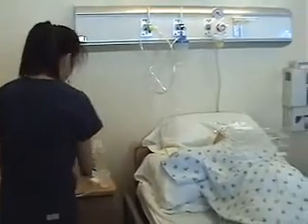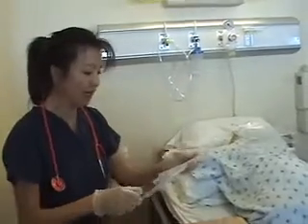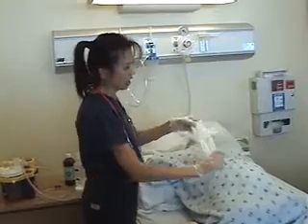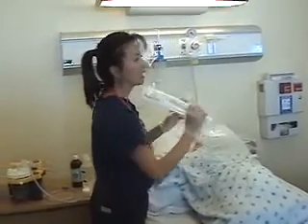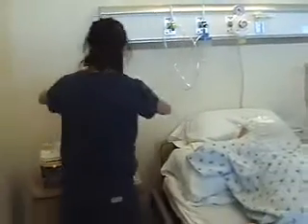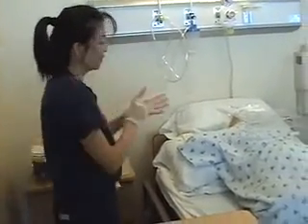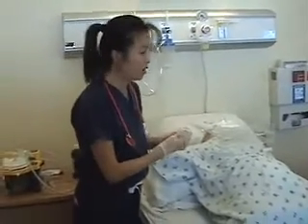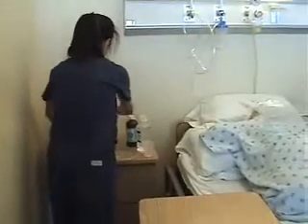Then this one is done, and this one you can just use repeatedly, and you can put it on the side. If the patient is completely alert and oriented, they can even suction themselves. Okay, then they can do this. So then you put this here. Then you go, your lungs sound like they're wet, and I'm going to perform suctioning. Okay, so this is what we do.